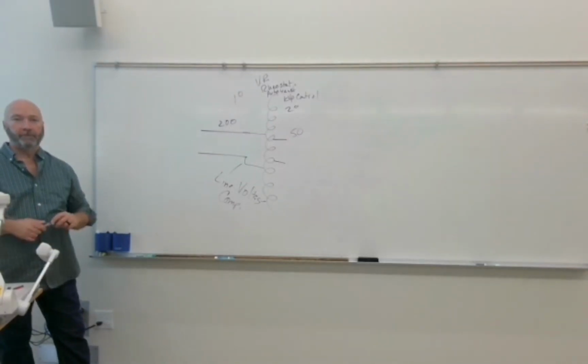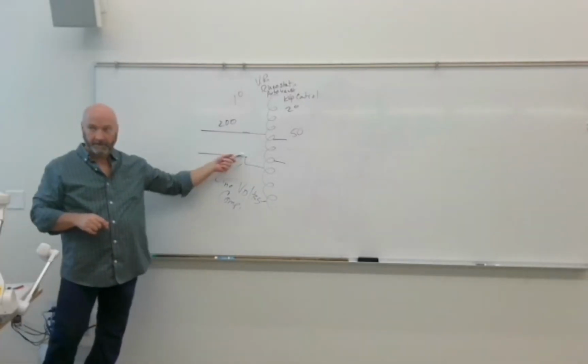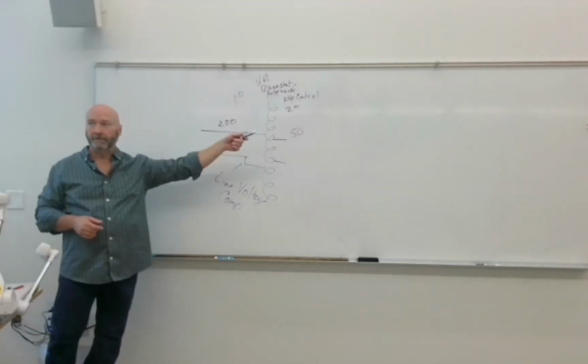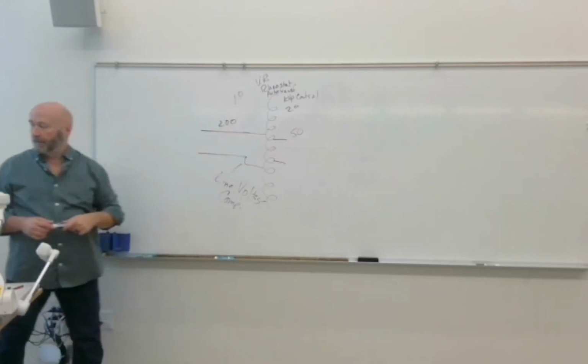Where does kVp come from? It's right there in the name: high voltage transformer, right? This is a transformer, but it's an autotransformer. It's the kVp selectors just adjusting voltage in anticipation of becoming kVp. It's not kVp yet. Okay.